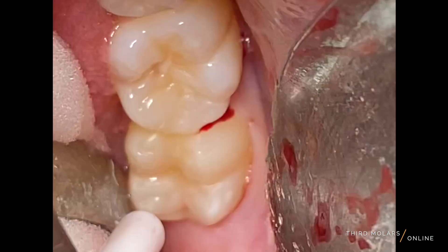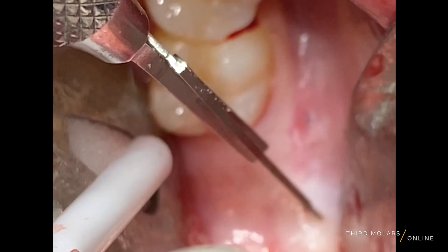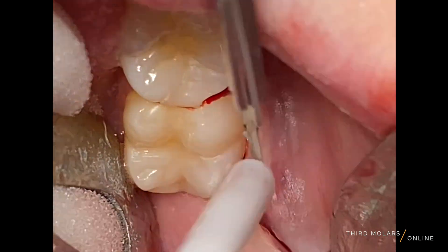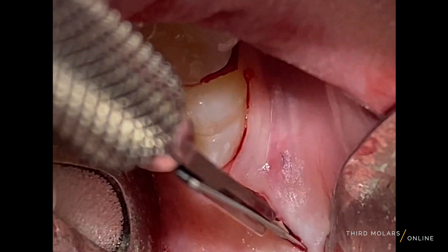This is why we make our flap designs towards the buccal and don't make incisions straight up the ridge on the distal of the second molar. All of our incisions are directed towards the buccal to not only provide us with great access and visibility, but also to protect that lingual anatomy.